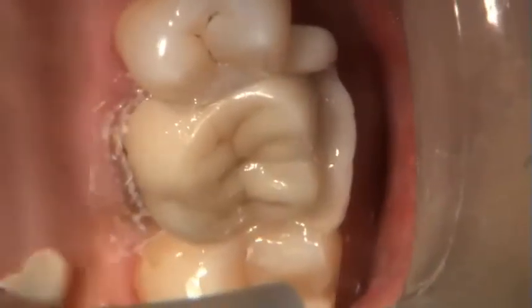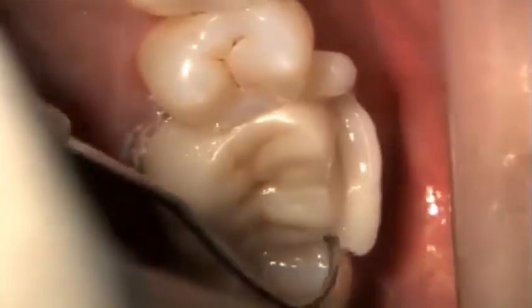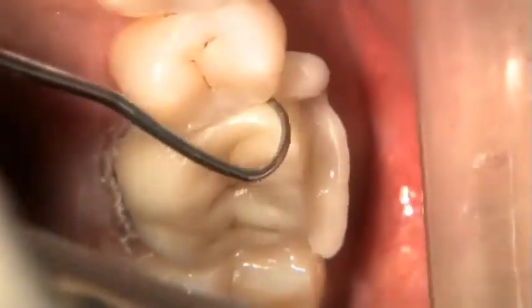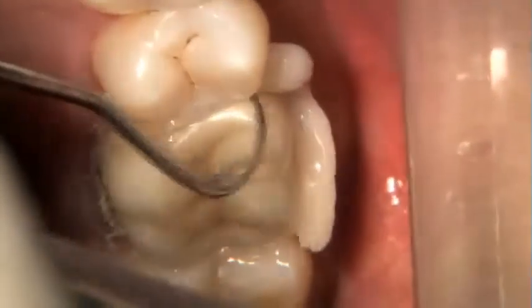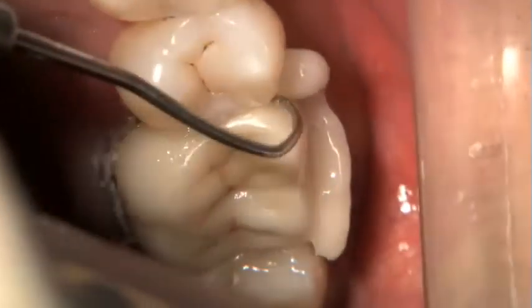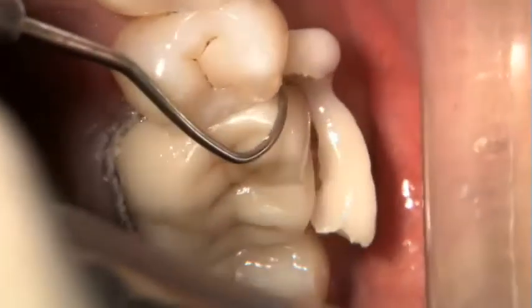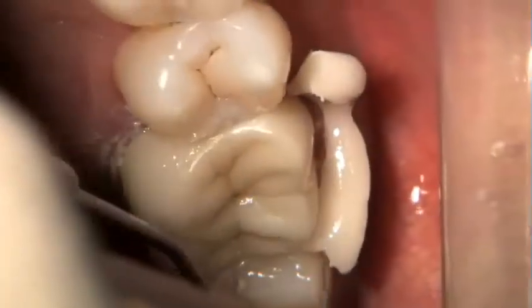Can you believe how easy that peels off? Just teasing it away from the crown — you saw it just kind of fall off and roll off there in one piece. Ordinarily my assistant's suction would have been there, but it would have been blocking the camera. I just want to point out how easy it is — this kind of one-peel ability to go in there and have it come off in one piece.